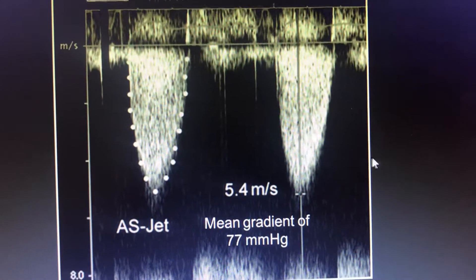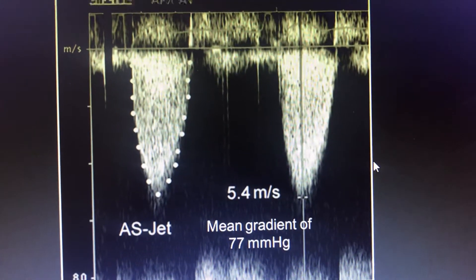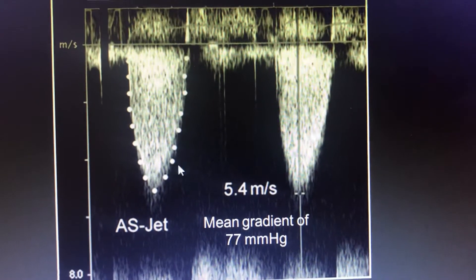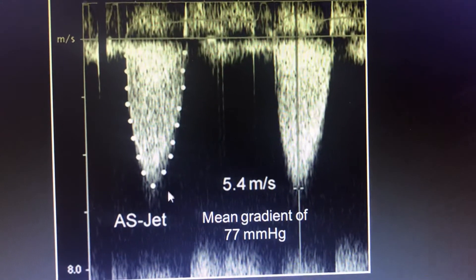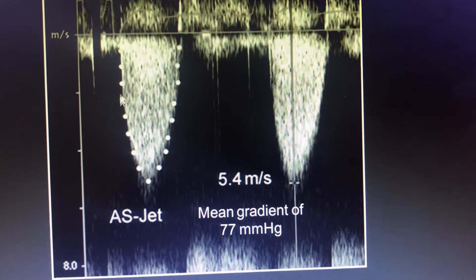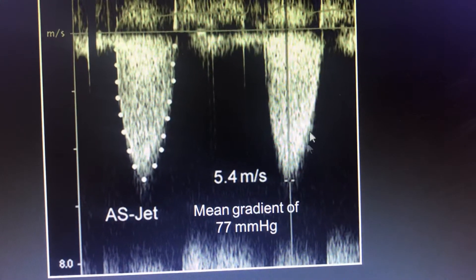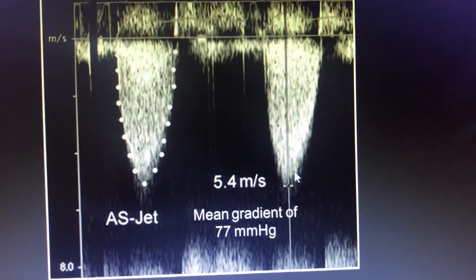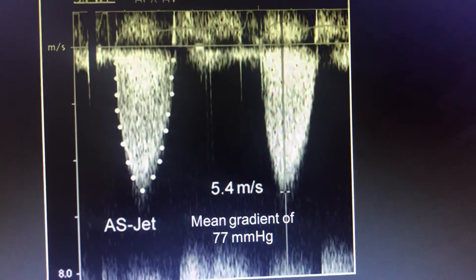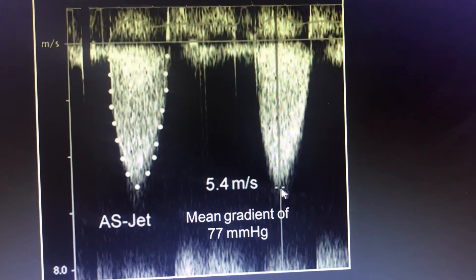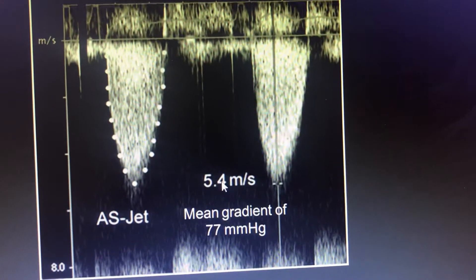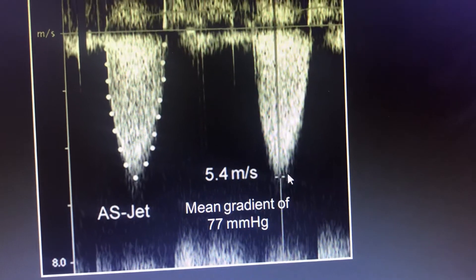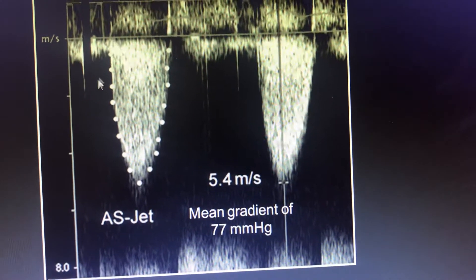At the aortic valve, the flow velocity will be high, so we use continuous wave Doppler. With continuous wave Doppler you get a smooth, peaked, bisymmetric curve — if you cut it in the middle, each half forms a perfect triangle. From this you measure two things: the peak gradient, where the peak velocity is 5.4 meters per second, calculated using 4V², giving the peak gradient. The mean gradient is also derived from this tracing.